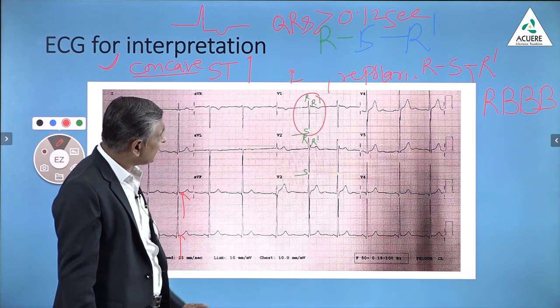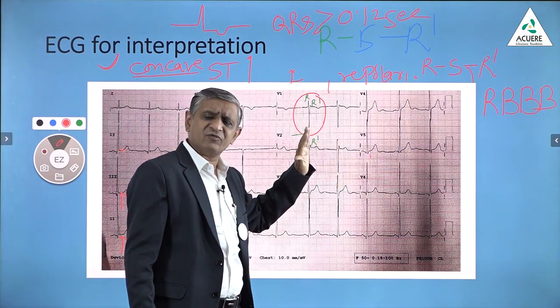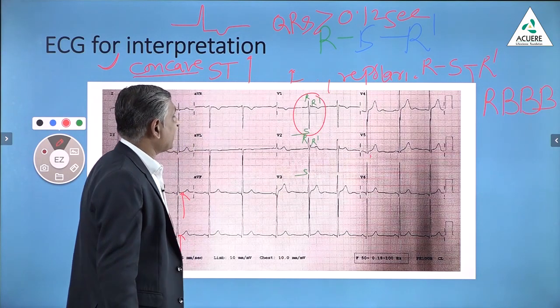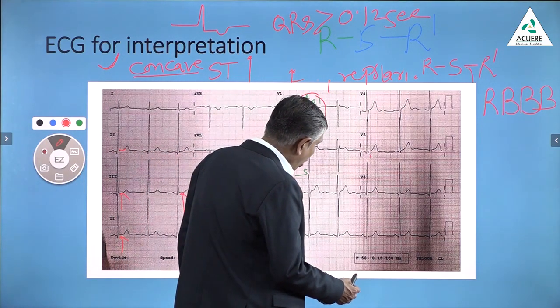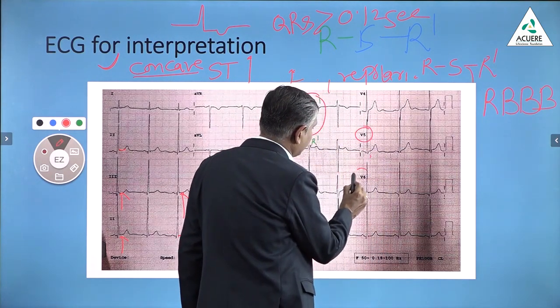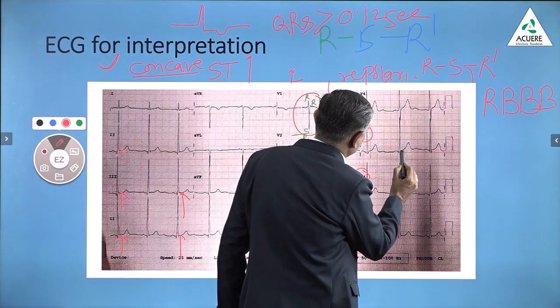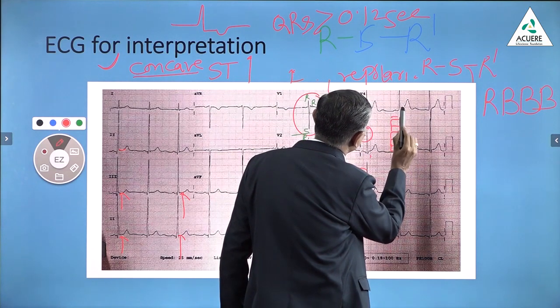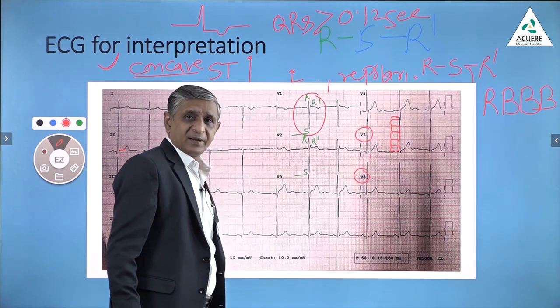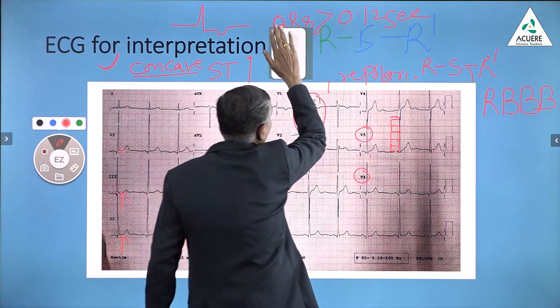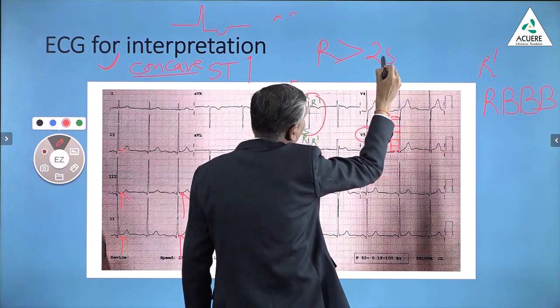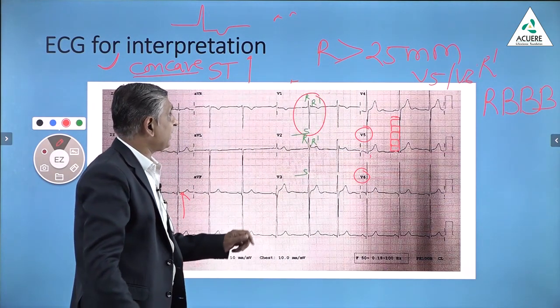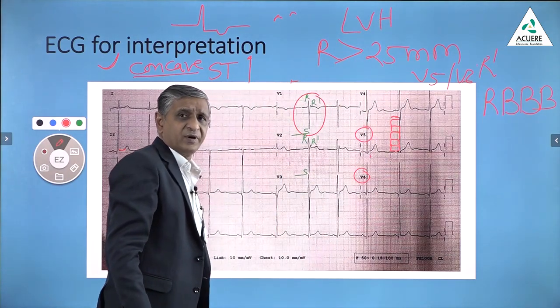This incomplete RBBB is again non-conclusive and is a variant of normal, many times seen in young individuals or sometimes in older individuals as well. The third thing I must tell you is the tall R waves. You can see in V5 or V6 — counting the large squares, the amplitude is more than five. When the height of the R wave is greater than 25 millimeters in V5 or V6, it is likely to be a case of LVH, that is, left ventricular hypertrophy.